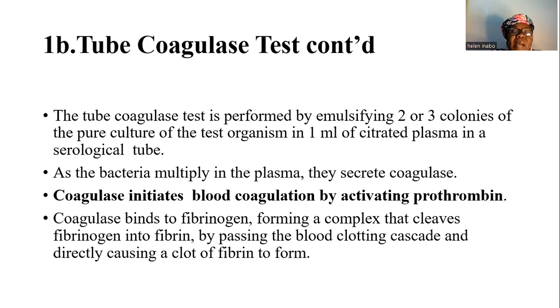So coagulase binds to fibrinogen, forming a complex, and this cleaves the fibrinogen, which is soluble, into the insoluble fibrin clot, which can be seen.